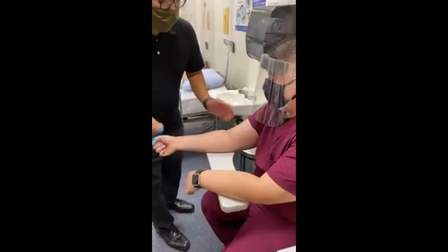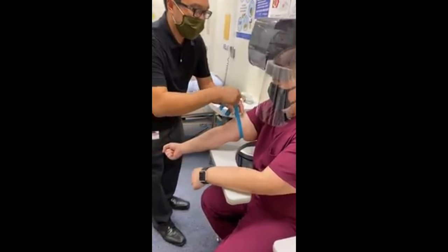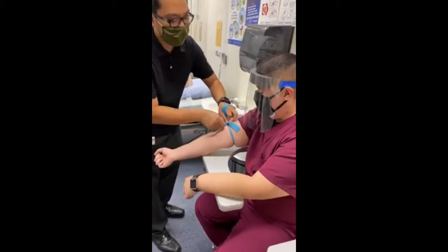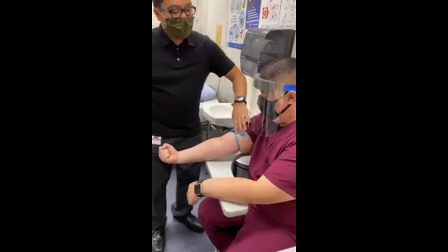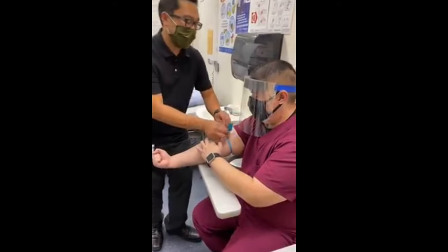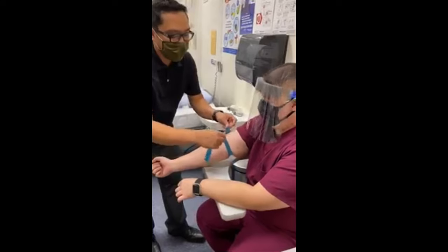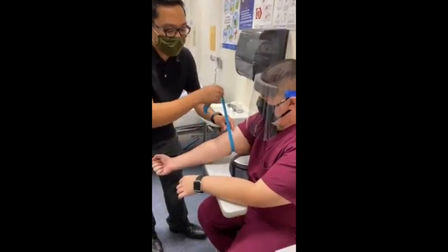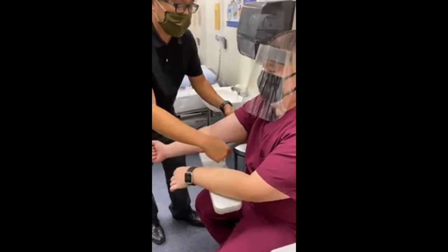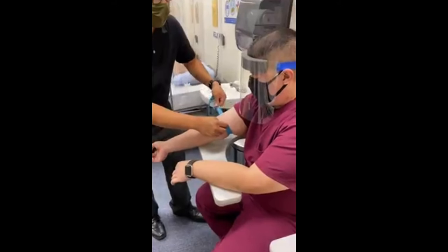So the way I did it, underneath. And then put it underneath here. So you'll have the bunny ears. There's some on the YouTube video, the guy does it like this. He puts it short here on this side, and then stretches it here. No, I think it's this way here. I think he does it like this. Short here, long here. So you're pulling this way.